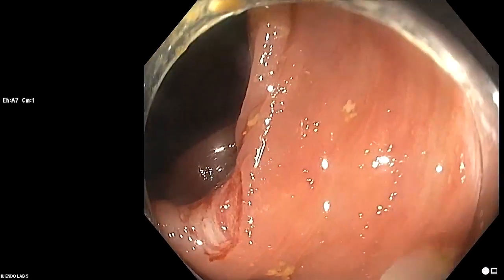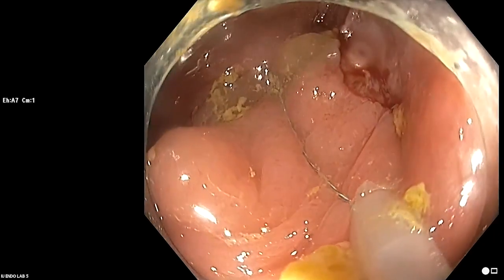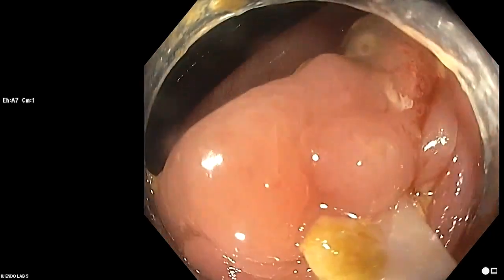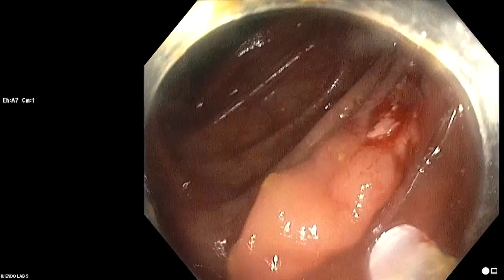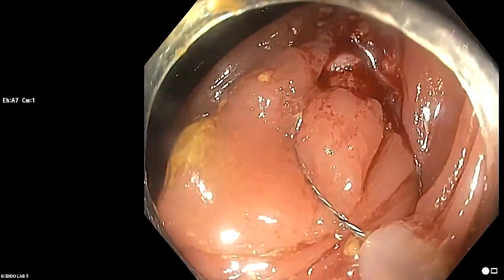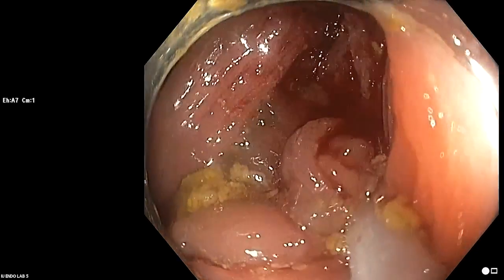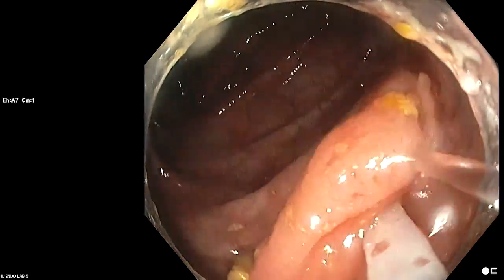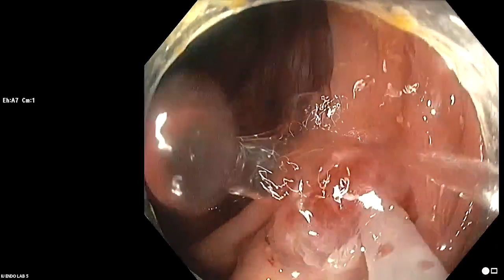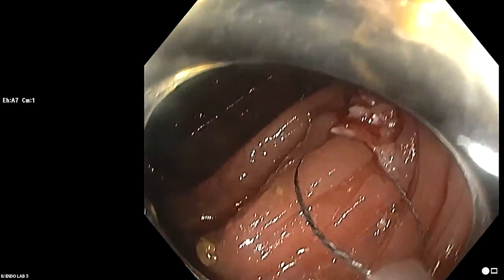Good size SSL, maybe 5 or 6 centimeters, back here. And I know you guys are ready to break away, but I just want to show you the other technique where we don't even inject, because you can actually see the margin quite well. And I'm using the same approach and no injection. And actually, this has been shown now. Michael Burke showed it first, but it was shown in another large study in the past year. Recurrence rate is very comparable to when we inject. It may be sort of difficult for you to see the margin, and once you get that initial cut in, we can use the water jet and just fill it up. And I think that this has a lot to say for it.